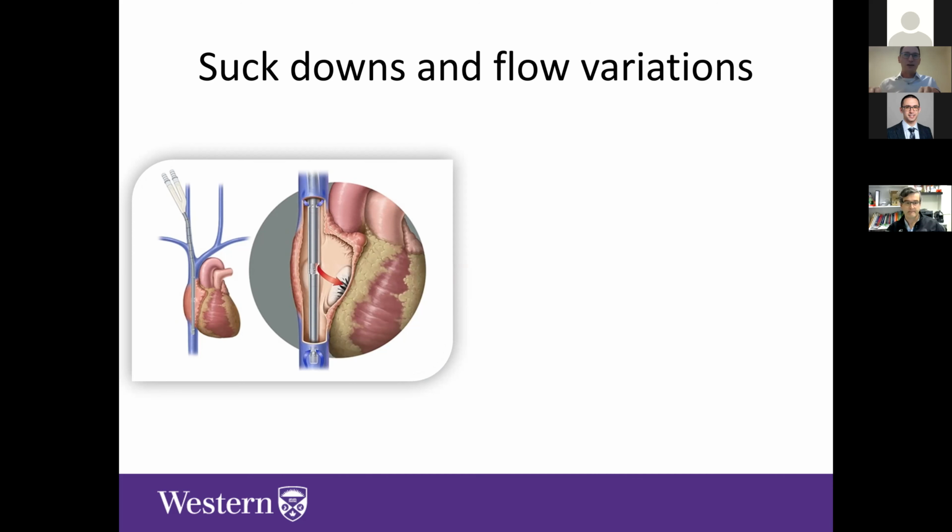And there's not a lot immediately in your toolkit to deal with that, as the nurse at the bedside, or someone who's unfamiliar with medicine, like one of the residents in the middle of the night. Really, your toolkit is fluid and paralysis, which isn't necessarily the optimal answer to that. And I'll just explain why.